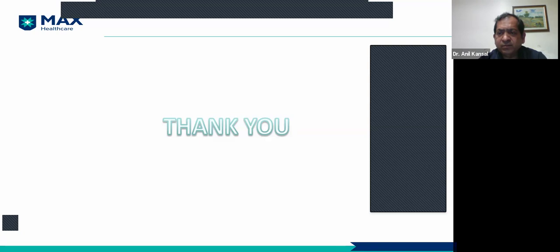We had a patient case where we had consulted you, but the cost was prohibitive for them. The patient was from Rwanda, so that 30,000 plus many. Different companies' equipment is available in the country. Few are very costly; non-chargeable is slightly less costly, but we have to change the battery after 5 to 7 years. Chargeable are slightly costlier. Newer modalities where we can also do monitoring are more costly. So whichever the patient opts for, we can use that in different patients.